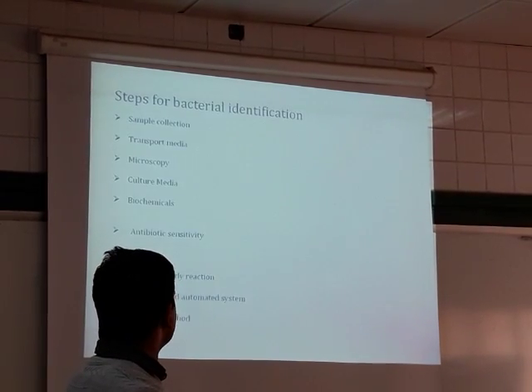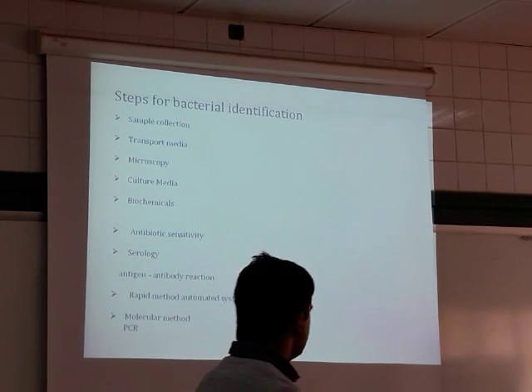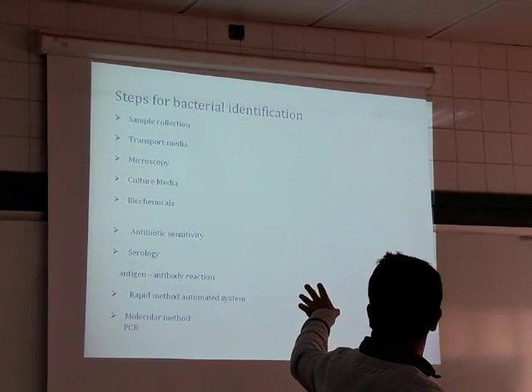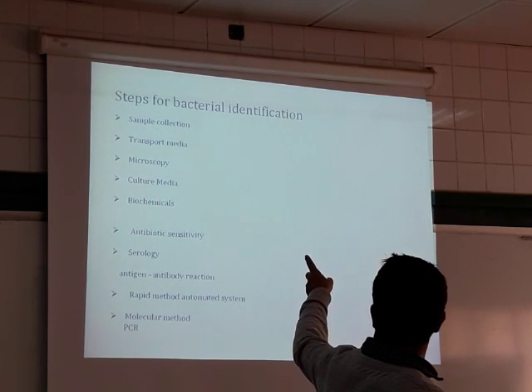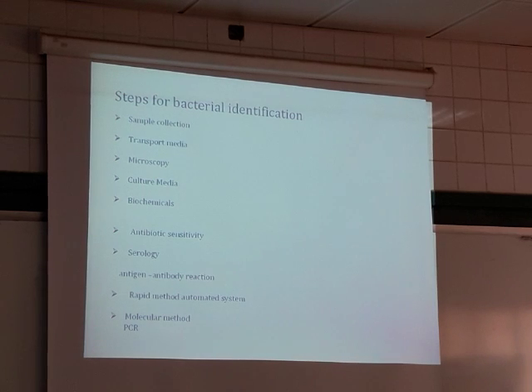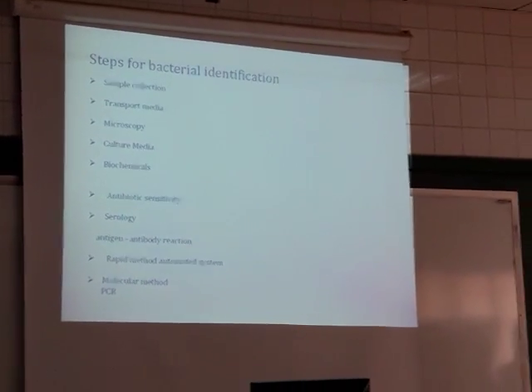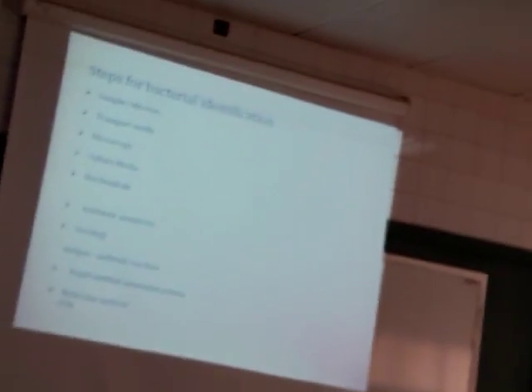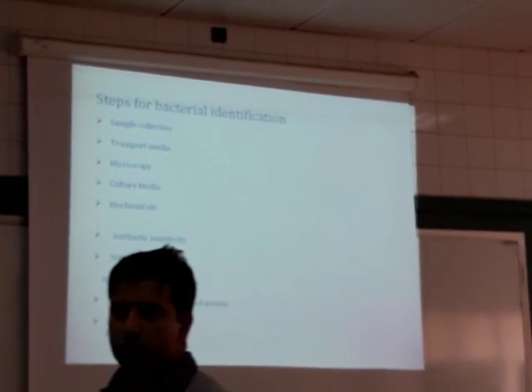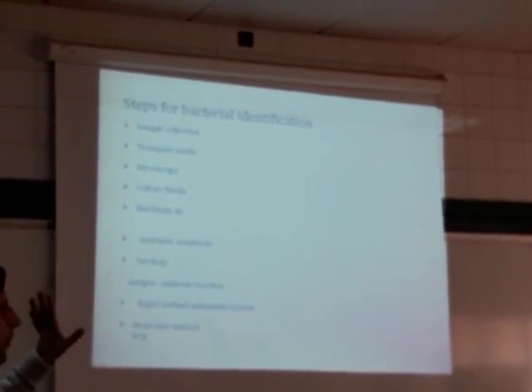So we have to diagnose. You are in the first year. Remember these steps from sample collection to microscopy, because from second year, third year onwards, we are not going to use first these two, sample collection and transport, because you should know it. It's very important to diagnose a pathogen in the laboratory. These steps should be followed.